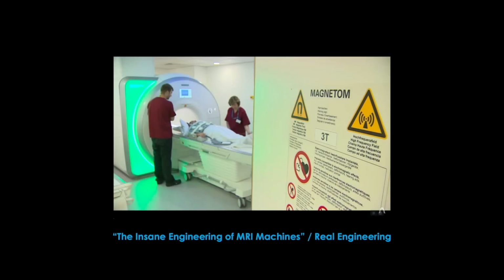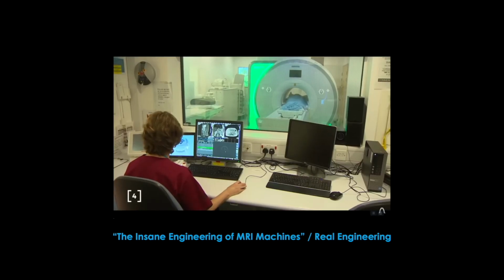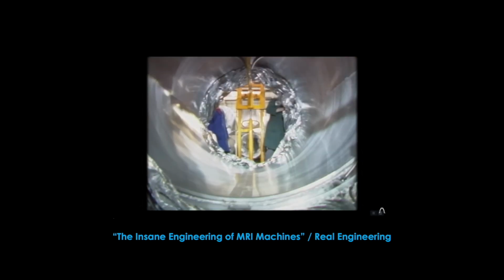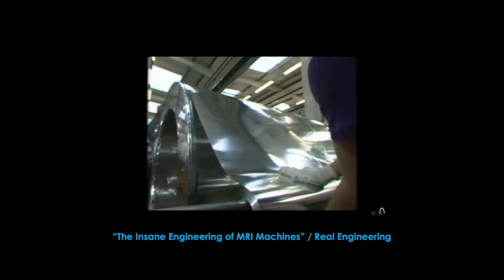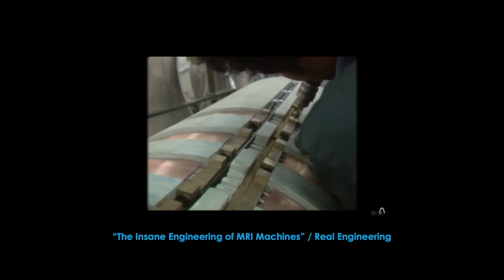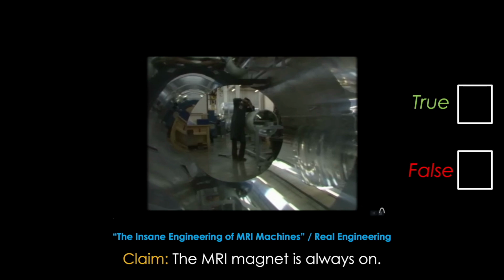Next clip. Higher magnetic fields require higher electric currents that would melt ordinary wires. To achieve larger currents in the wires, engineers required superconducting coils. This means that the main superconducting coil in MRIs does not consume any power directly. Rather, the main consumption of energy is just to keep the coil cooled down, so the current will travel endlessly, leaving the MRI magnet permanently on. Claim: The MRI magnet is always on.